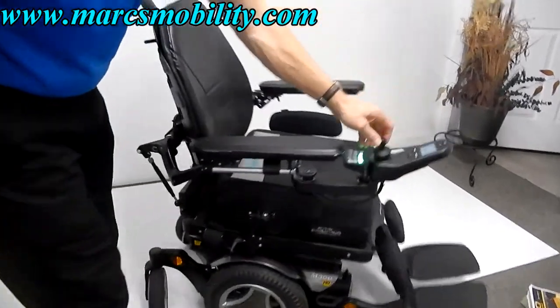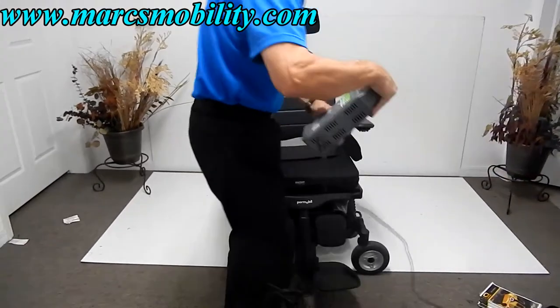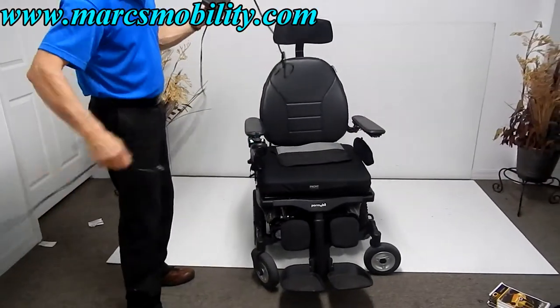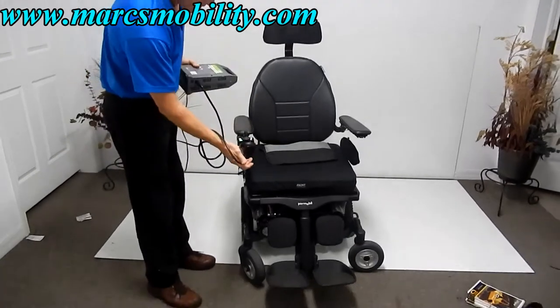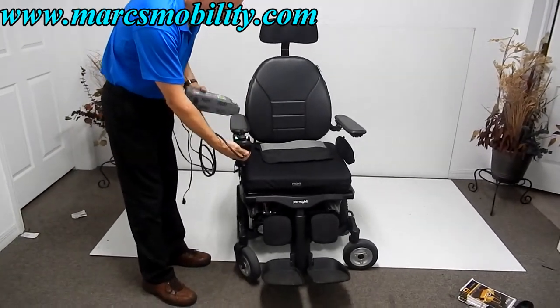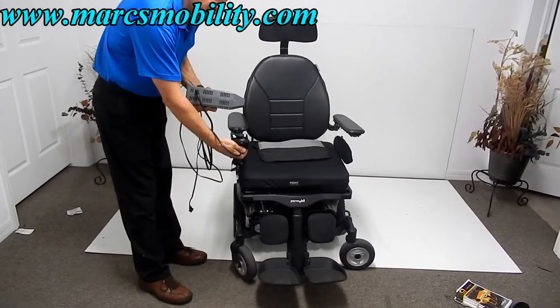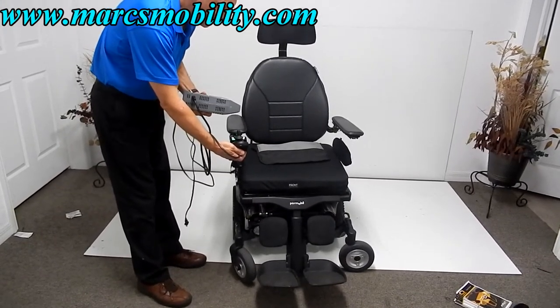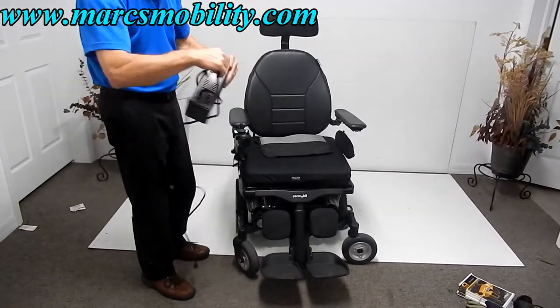If you need to charge this chair, take your Permobil charger, plug it into the wall, and plug the receptacle cord into the bottom of your joystick. When the charger turns green, it means it has stopped charging. The charger will recognize when the batteries are full and turn itself off completely, so you don't have to worry about overcharging the chair.